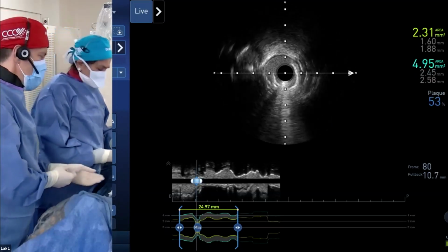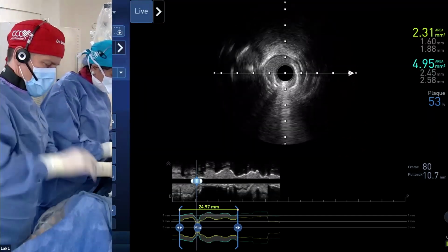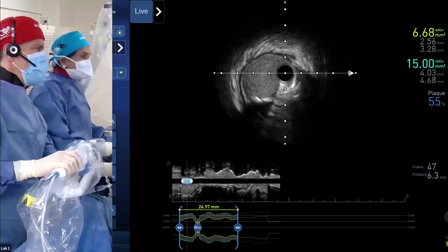You see no ablation. It means the upsizing. Well, calcium ablated surface. That's why IVUS going into the diag would be really helpful. Yeah, that's where I'm going now. And then we can make a decision.